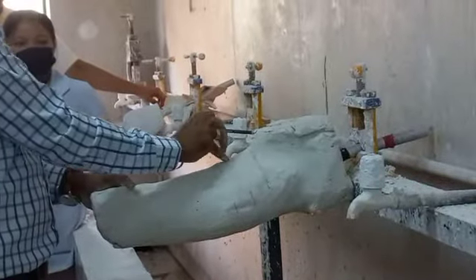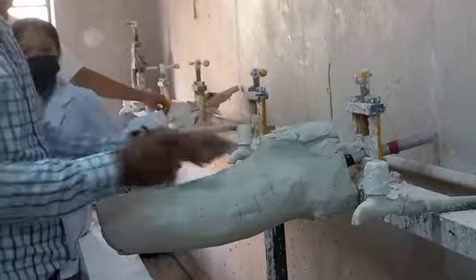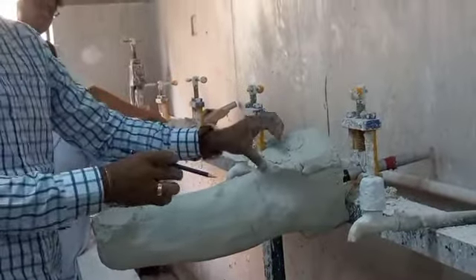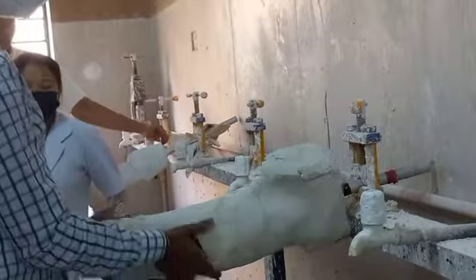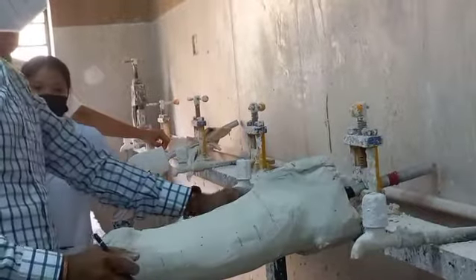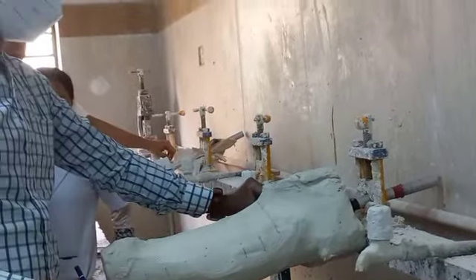So here our design is ramal containment only, and therefore we are not covering, our brim is going down. To what level? To the level of the gluteal crease. The gluteal crease is going down. On the lateral side, it's covering approximately 10 centimeters from our lowest point on the posteromedial aspect, right? 10 centimeters approx. How much in inches? 3.5.